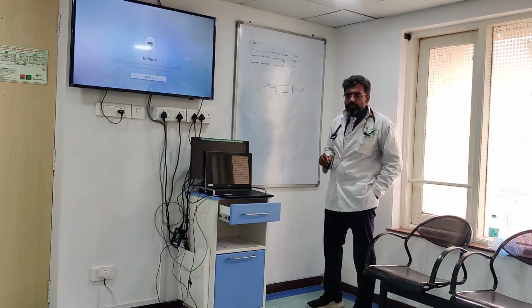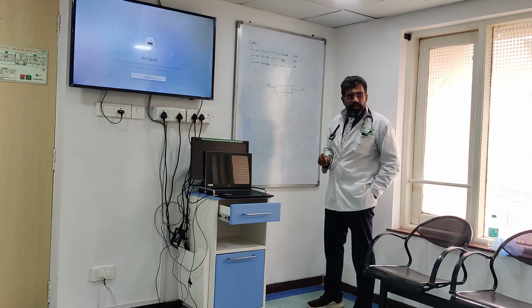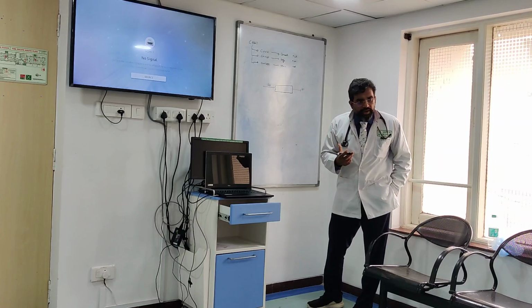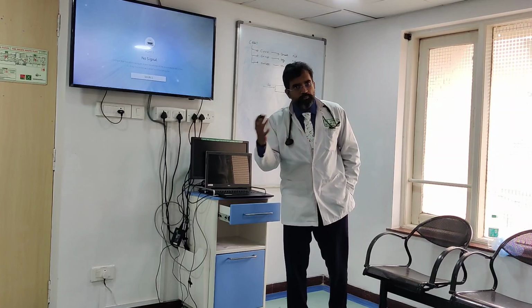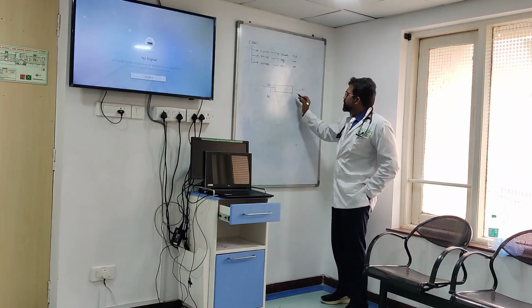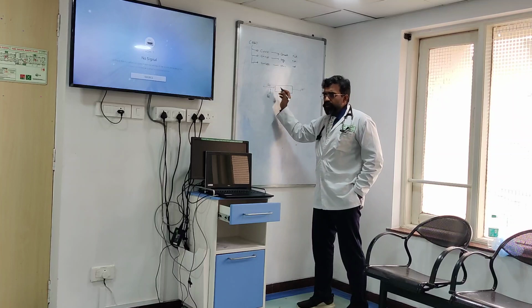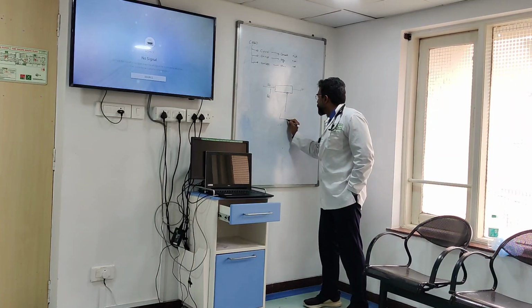And now what do I want to do? What is more happening over here? I am going to add a replacement fluid. And as we discussed the other day, the replacement fluid could be either pre-filter or post-filter. So I can have a replacement fluid here, or I can have a replacement fluid here. All these filters will have a small port from which it will go into the effluent bag.